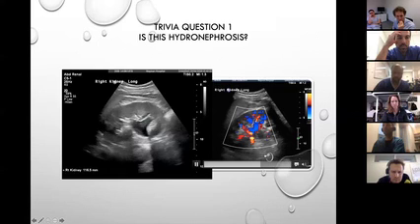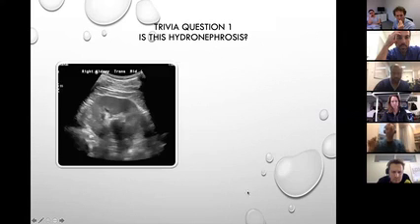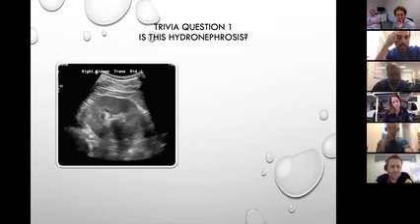All right. So when I go transverse, that's your whole kidney. It is kind of sitting in the middle with a roundish structure there. So that's a cyst, possible. Could be. If it is a cyst, what would you call that? It's going to be more like a parapelvic kind of cyst. Or what is another one that could be?